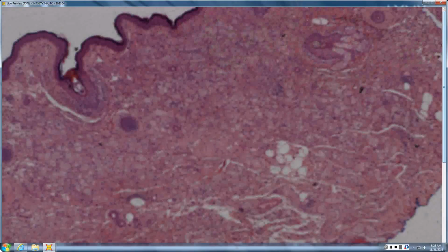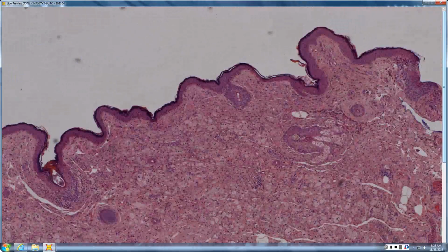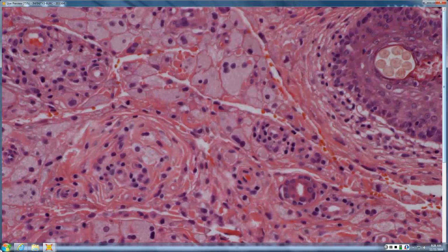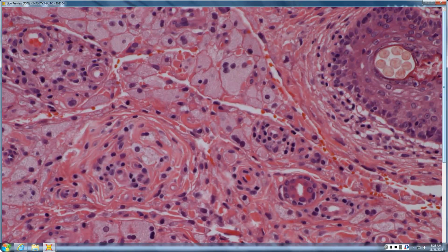I thought this was a granular cell tumor. So it is very delicate skin, and are these granular cells or lipidized xanthoma cells? Do you see any giant lysosomal bodies as you would in a granular cell tumor? I think you're tricking me, but your tone reflects whatever.